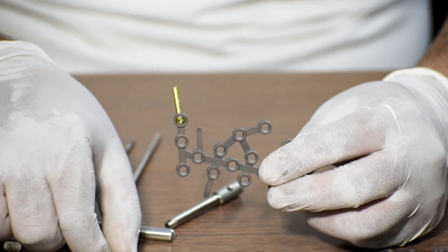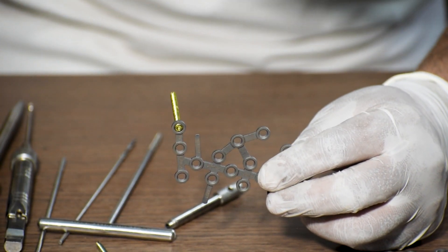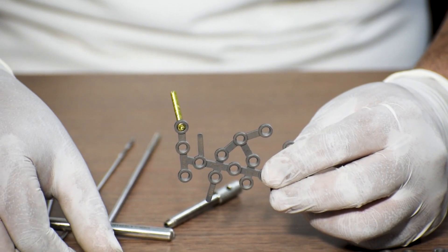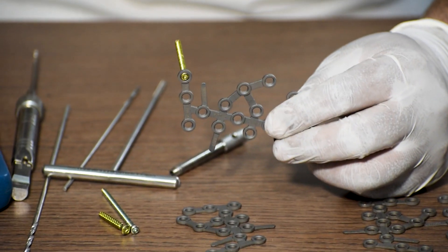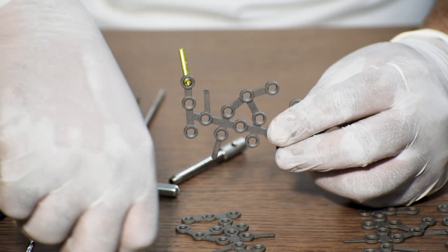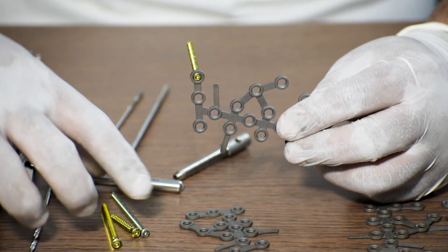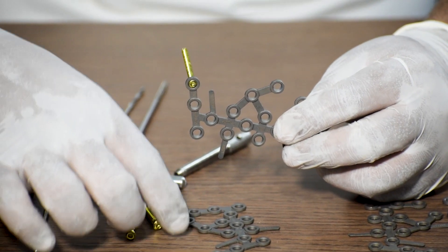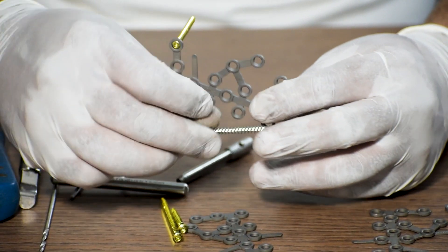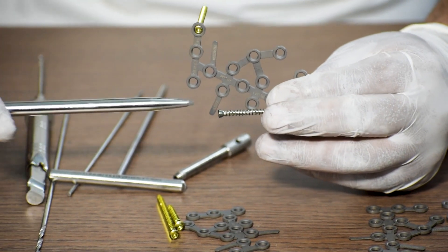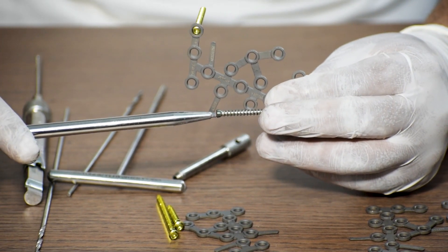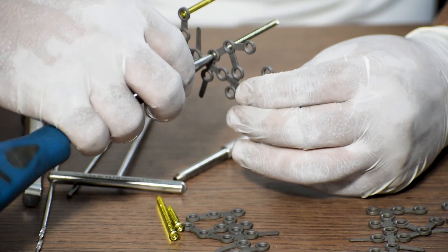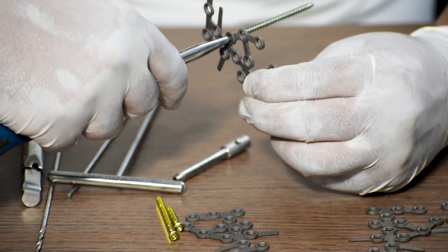This is a 3.5 mm locking cancellous screw and this one is a 4 mm full thread cancellous screw. Cancellous screws are generally compatible with cancellous bones. You can either use a locking cancellous as we are considering here. We are using a 3.5 mm screwdriver and we fix it on the desired hold.